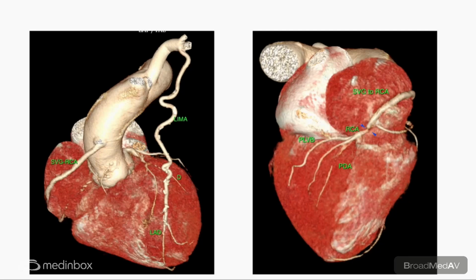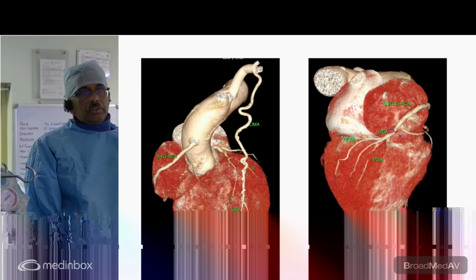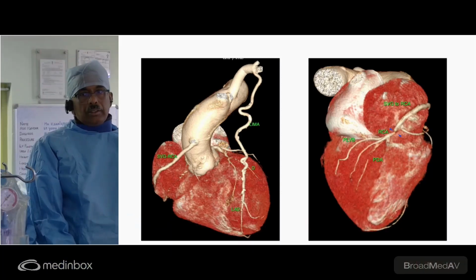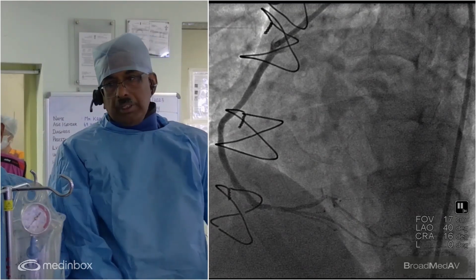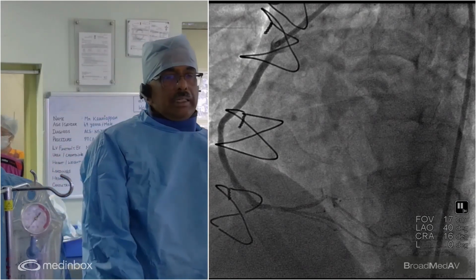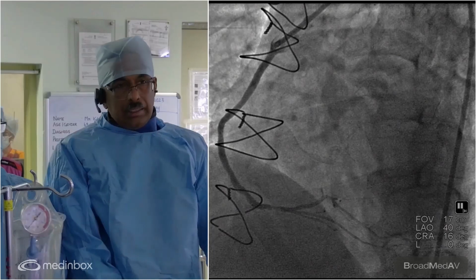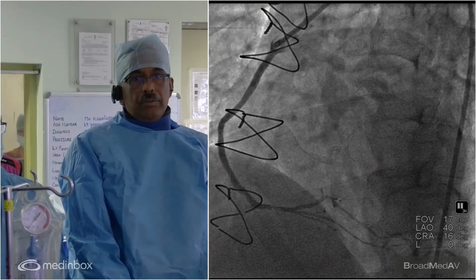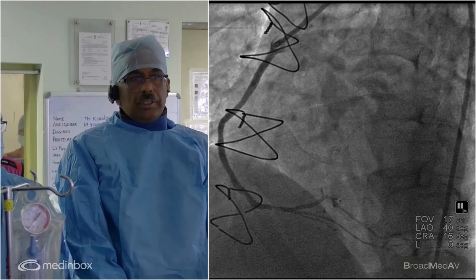Okay, thank you, Ashish. This is the angiogram. To hook the graft, we don't do angiograms as diagnostics before doing the case. Most of us do CTs first and then make a decision, and that's the current recommendation. Post-CABG patients who come with angina need a CT scan first and only then a diagnostic angiogram, because it saves a lot of dye injection and unnecessary hooking of grafts. So here it's very clear.